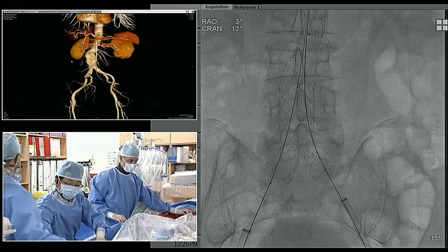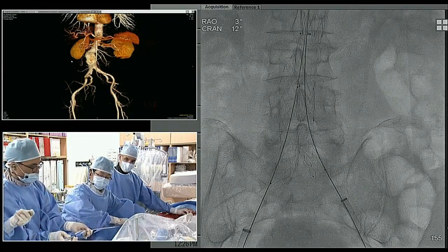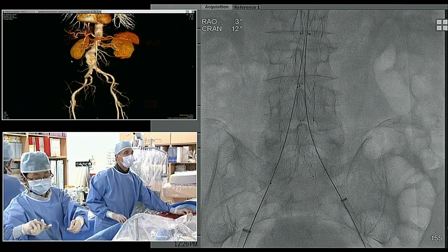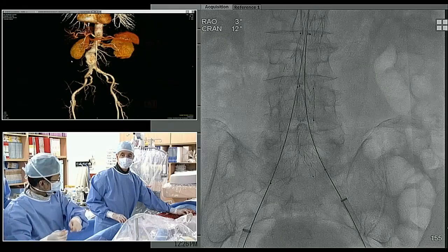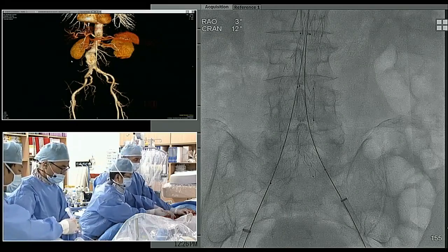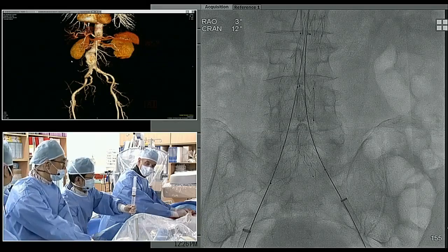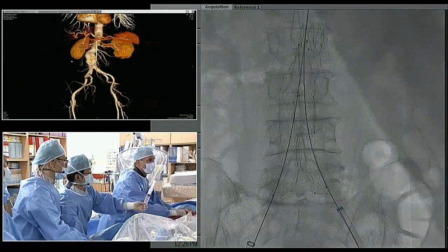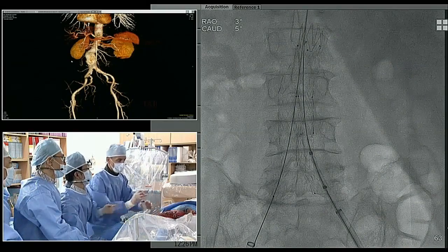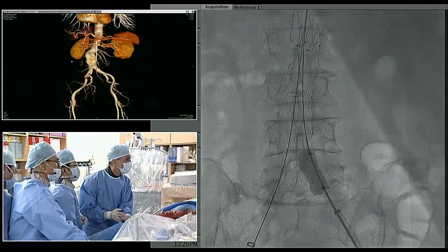Comments from the panel? When the kidney is normal, I try to stay with the CT scan, but creatinine has little problems. Recently I do the ultrasound with the ultrasound contrast. So many of us have evolved to doing the 30-day with contrast to make sure there's no endo leak, and then if it's a well-functioning graft with no endo leak, then transition over to ultrasound. I'm hearing some nods in agreement, a lot of operators doing that? Yeah, I would agree with that.